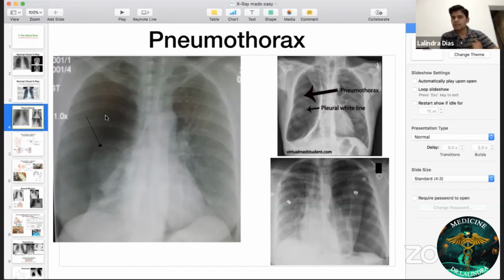You just prick into that pleural space, and then you can hear the sound zzz, like that, air goes out. You can also connect a tube to that needle and drain that air under water seal. You can take a kidney tray filled with water, and you can see air bubbling through there, and the patient's tension is relieved, and the patient is completely back to normal. Then you have relieved the acute tension. Then you take a chest X-ray and confirm the X-ray finding of pneumothorax.